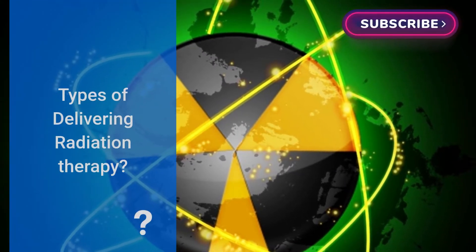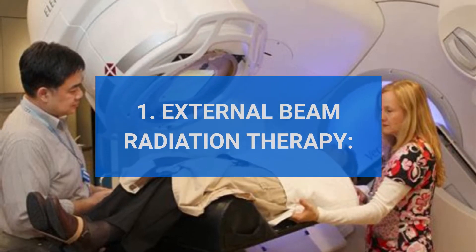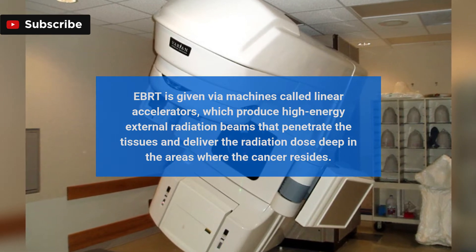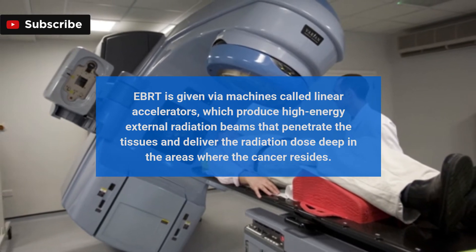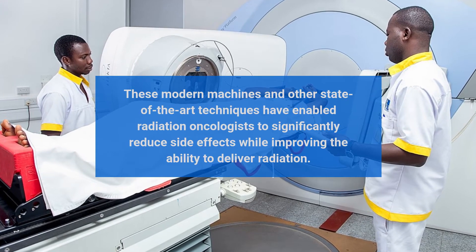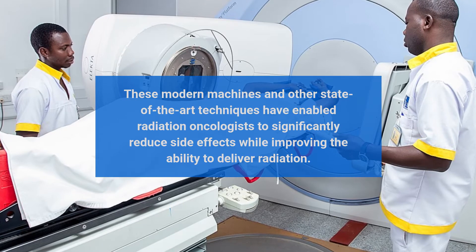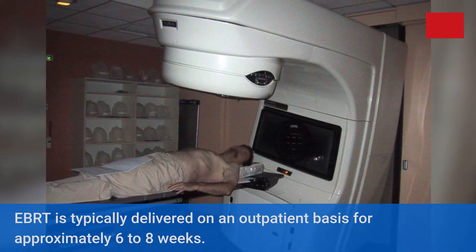Types of delivering radiation therapy. External beam radiation therapy (EBRT) is given via machines called linear accelerators, which produce high-energy external radiation beams that penetrate the tissues and deliver the radiation dose deep in the areas where the cancer resides. Modern machines and state-of-the-art techniques have enabled radiation oncologists to significantly reduce side effects while improving the ability to deliver radiation. EBRT is typically delivered on an outpatient basis for approximately 6 to 8 weeks.